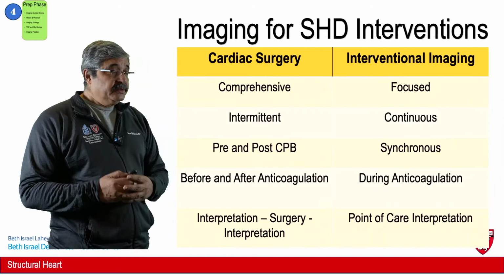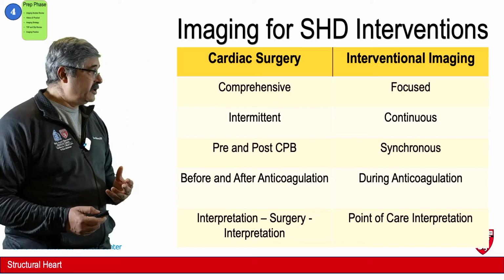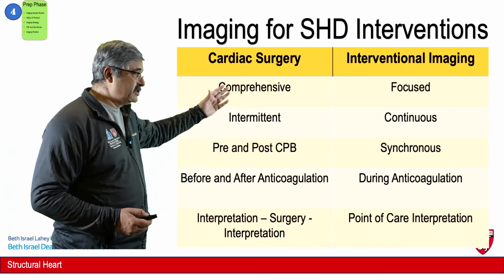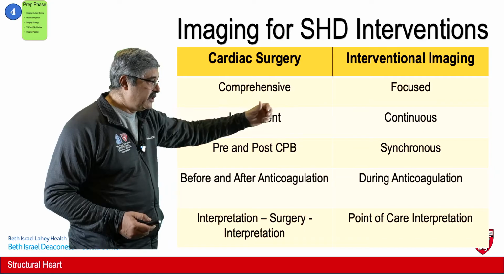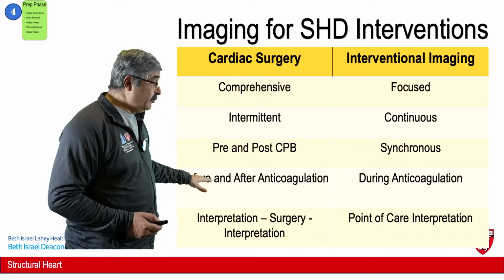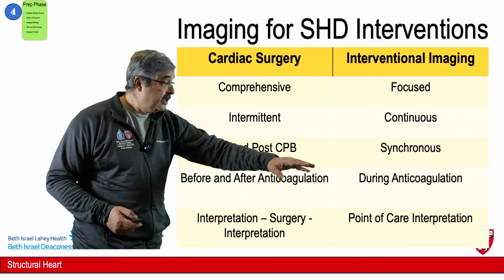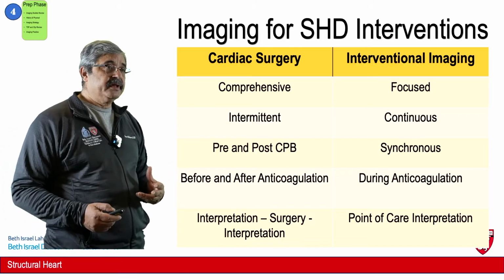Just because you've been doing imaging for cardiac surgery doesn't mean you're good for structural heart disease imaging. There are significant differences. Cardiac surgical imaging is comprehensive. This is focused. This is intermittent. This is continuous. This is before and after bypass. This is synchronous with the procedure. This is before and after anticoagulation. That is during anticoagulation. So therefore, more complications have been reported with imaging for structural heart disease.